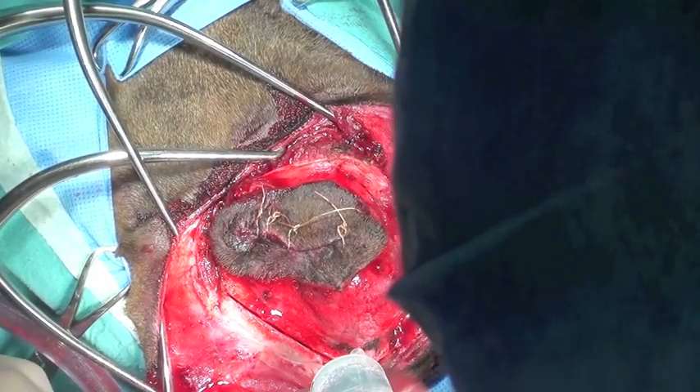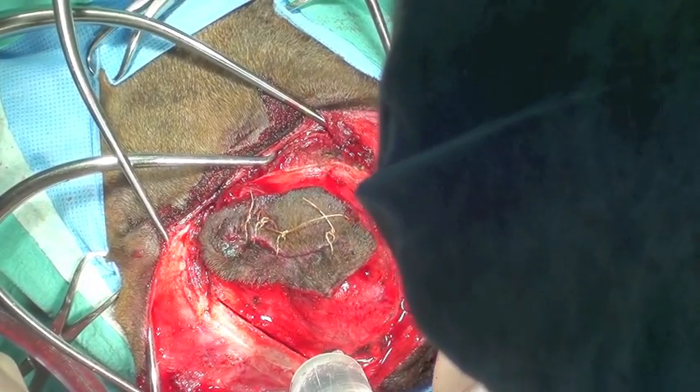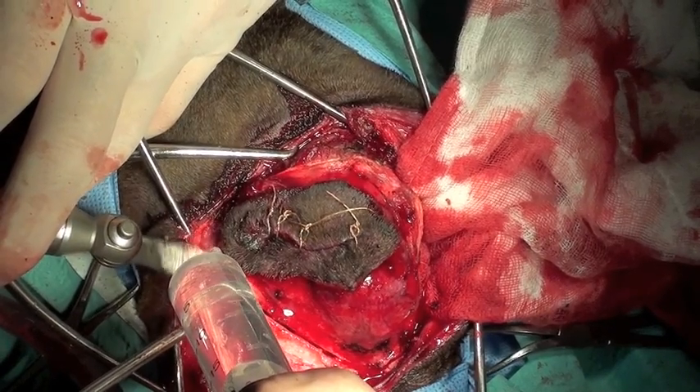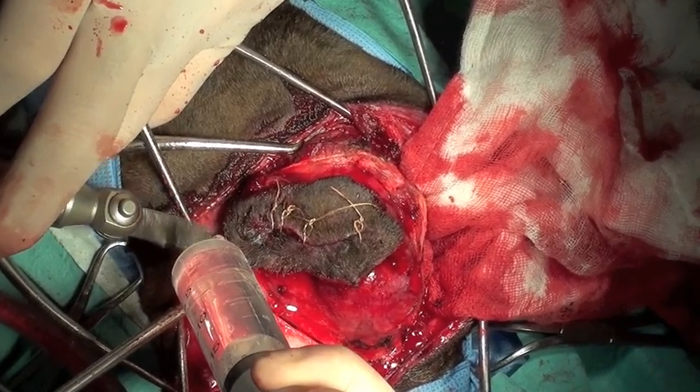An oscillating saw is used to perform osteotomies of the skull surrounding the tumour in order to get a complete margin. It's important to lubricate with saline in order to prevent too much heat production from friction.